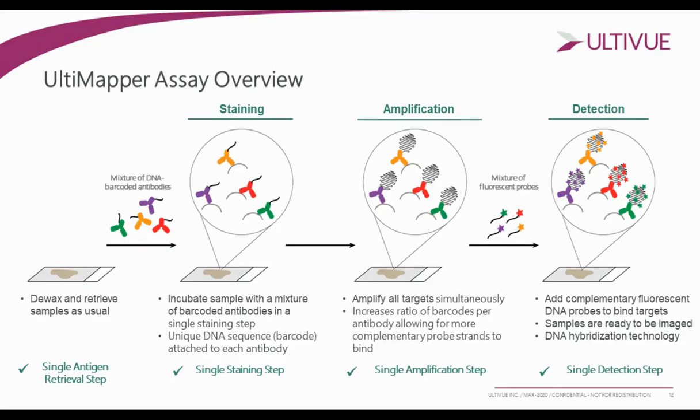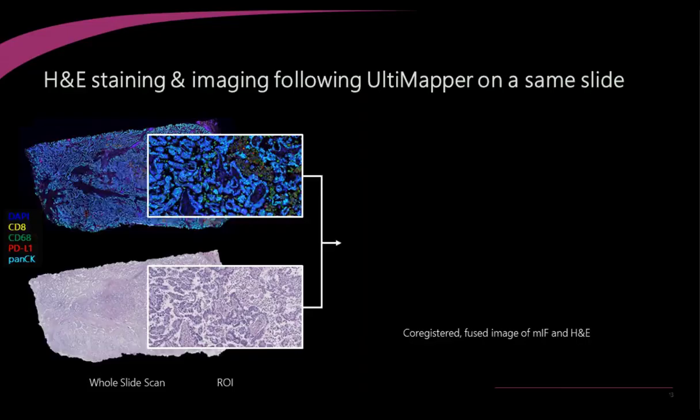Another thing to consider with this assay is that since we're not using secondaries, we're not providing a technology that causes any sort of covalent bonding or caking of things, such as a tyramide platform may do. It allows us to quite easily co-localize numerous markers within even the same cellular compartment at the same time. And this technology also allows for the tissue to maintain very good quality and integrity, meaning that the assay can be used for other downstream types of analyses.